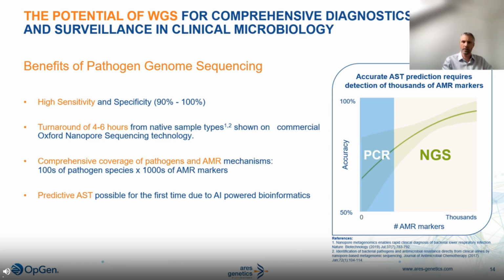and its utility for microbial typing and epidemiology is already undisputed. It is the first technology that, thanks to an enormous sampling depth, is not only very sensitive but also captures the entire genome, allowing for an exhaustive characterization of genetic AMR markers in a single test. And as I mentioned, comprehensive genomic information generated by WGS provides us a chance to use artificial intelligence and predictive modeling to emulate culture-based AST and predict which antibiotics represent suitable treatment options. With sequencing costs and turnaround times rapidly decreasing, the opportunity for complementing molecular testing, thereby revolutionizing the standard of care in clinical microbiology, is now no longer out of reach.